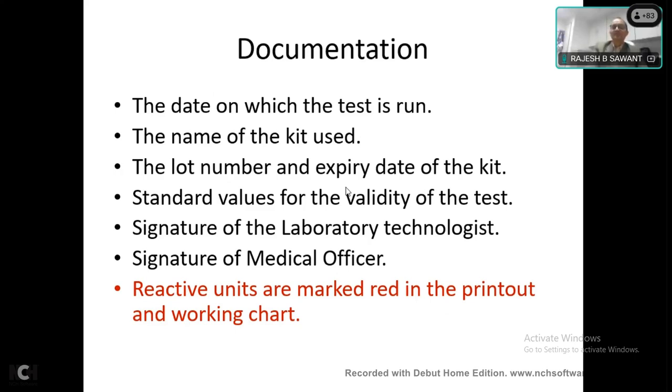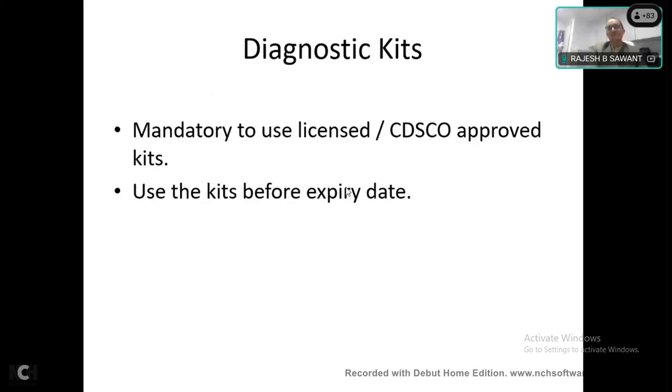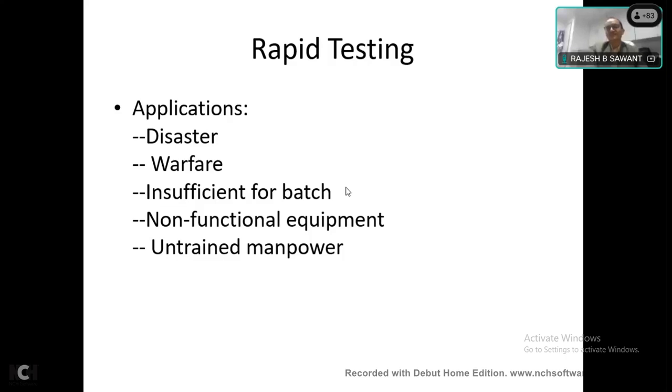What is important is doing proper quality assurance of these tests by using an external positive control. You have various licensed kits available, but the problem in India is that there is no uniformity in testing. You have a spectrum of kits available, from the basic kits to the best possible kits, and therefore blood safety can vary from blood center to blood center, region to region, city to city.